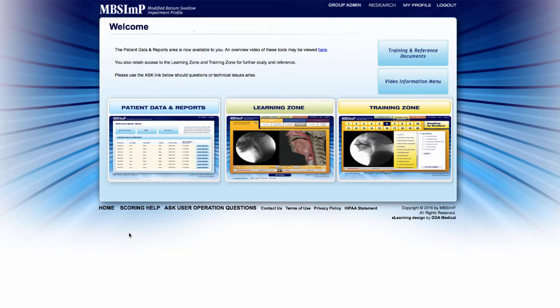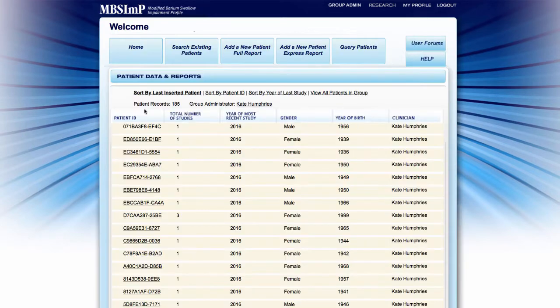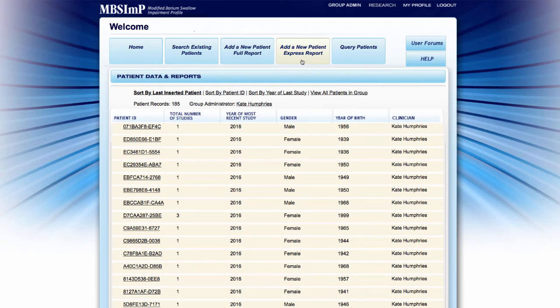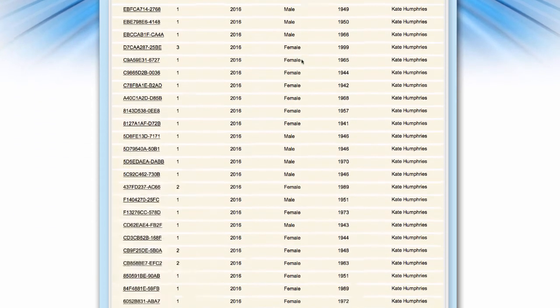To access the Express Report, click on the Patient Data and Reports link on the home screen. Once you are redirected, scroll to the top of the Patient Records screen and locate the Add a New Patient Express Report link.